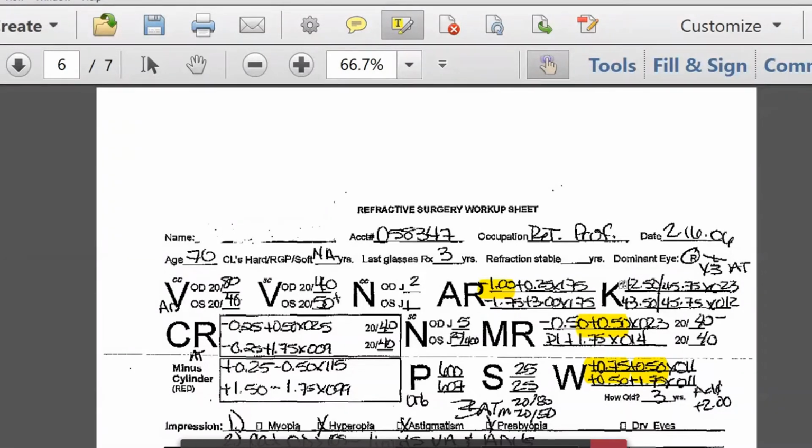This is because of many variables. One is that different instruments measure different cornea surface areas. Secondly, it could be measurement error due to the technician performing it. Third, it could be due to dry eye, right? By the time the patient reaches a different instrument, the eyes are not as optimum as before, and you can have differences in the readings. So the key here is to try to get these readings as close together as possible.